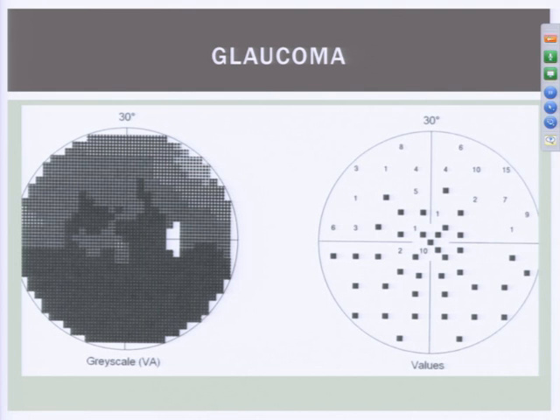Again, the same problem happens when the person fixates on something. They're going to shift back up to their normal position. But when the eye is not fixating, when the eye is in what we call the primary position or the resting position, which it often is when you try to mobilize, shifting the images to the part of the eye that sees is very helpful in terms of mobility.